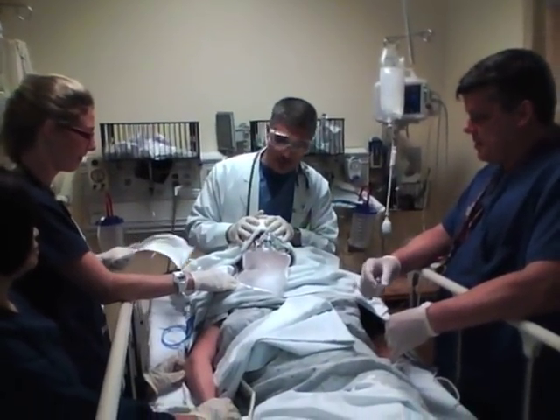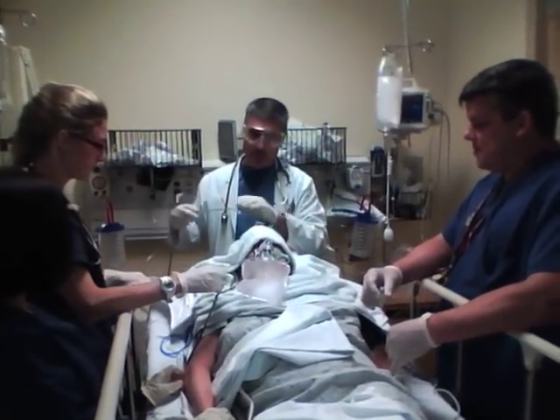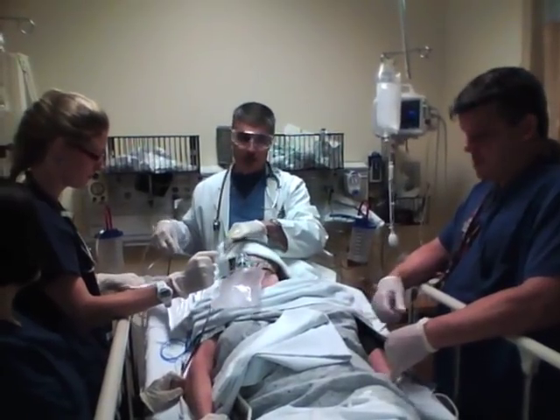What we're going to do is rapid sequence intubation. This patient is in overdose, so she's not all that responsive, but she's not protecting her airway all that well. So what we're going to do is intubate her to protect her airway.